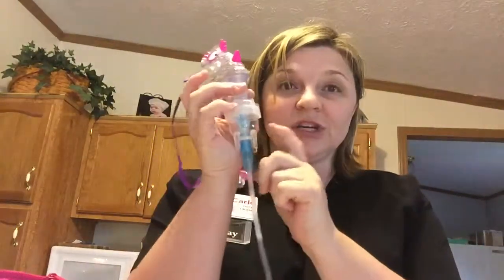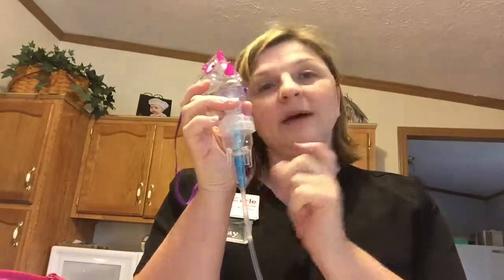It lasts about five to ten minutes. Ten minutes is long enough — the liquid should all disappear, but every time we've done it there's still liquid in there, so don't worry about it. If she has it on ten minutes, that's long enough.